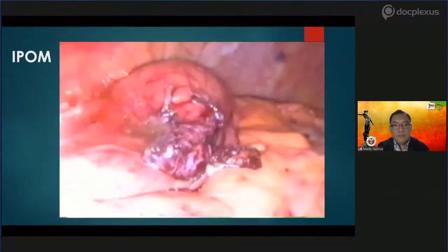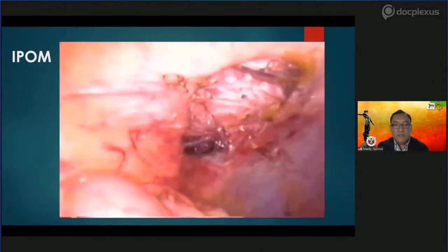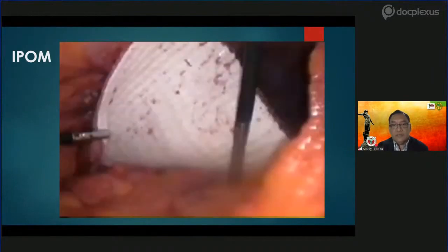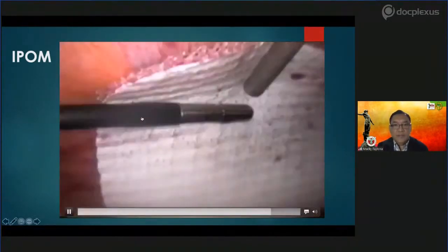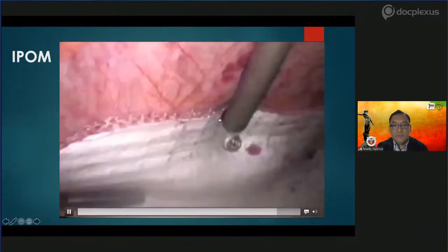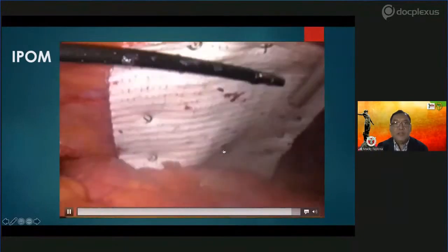So cold scissors, this is the surgeon looking at possible bowel injury. And then this is an old video, as I mentioned. You still have this PTFE underneath and a Prolene mesh above. So the mesh was, of course, fixed with a double crown technique.